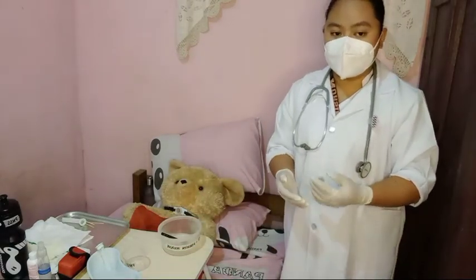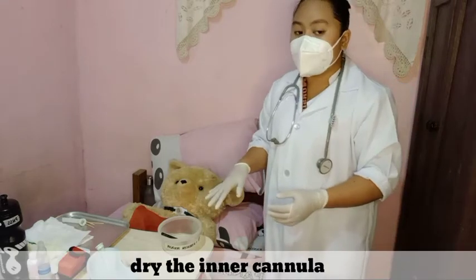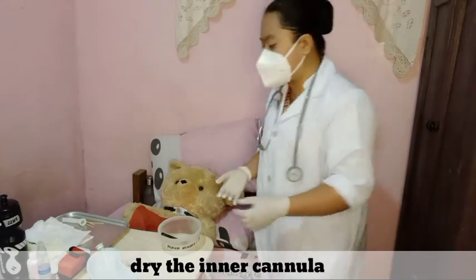Discard gloves and put on another set of gloves if necessary. Then dry the inner cannula using sterile gauze pad.